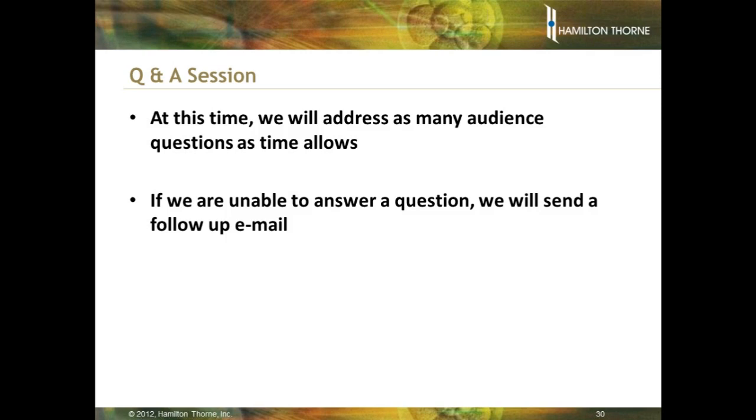It has happened where we will hatch the embryo completely by tugging too hard, and that is not a problem for us. Completely hatched blastocysts work fine. They are slightly more difficult to manage. However, it is not really a clinical issue with respect to outcomes.